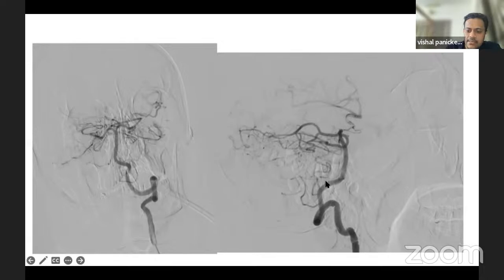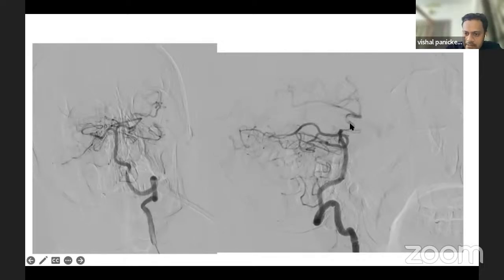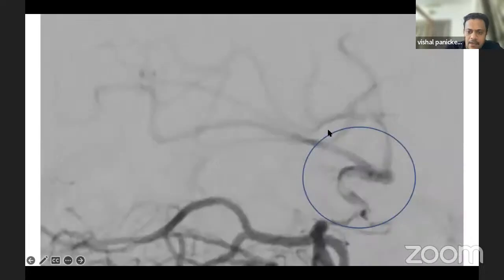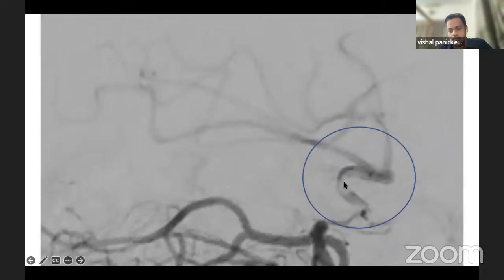In the lateral view, we can see the basilar artery and the PCA. Ideally, we can see the PCOM, and it is filling into the MCA territory. If you look carefully, we can see a thrombus lying in the M1 segment of the MCA.